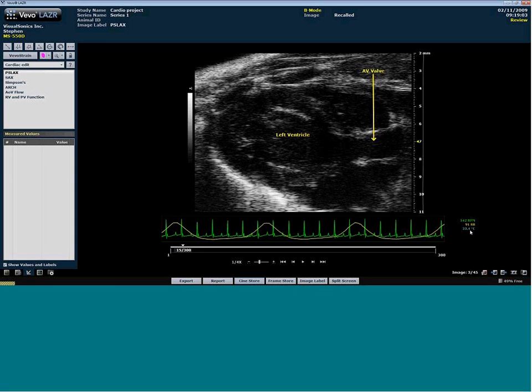I think some of the earlier documentation, some of the earlier training stuff that we had said, I can't remember if it's liters per minute or milliliters per minute. I can't remember what the scale is. I try to keep it actually a little bit lower. I try to keep it at around 0.8 for mice. You do have to drive it up a little bit higher for rats, sometimes just because of the increased body weight. That's what I've generally found with ISO.